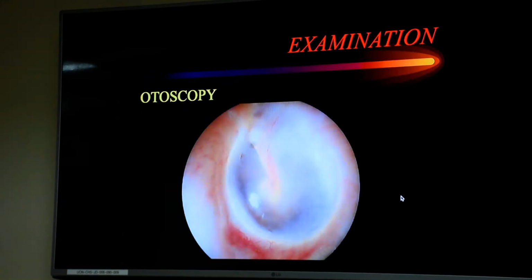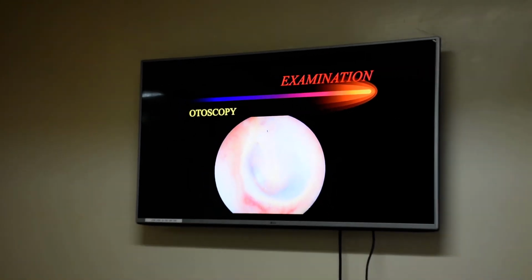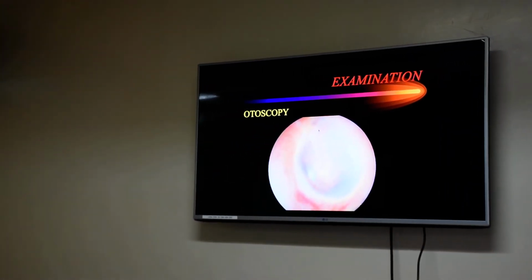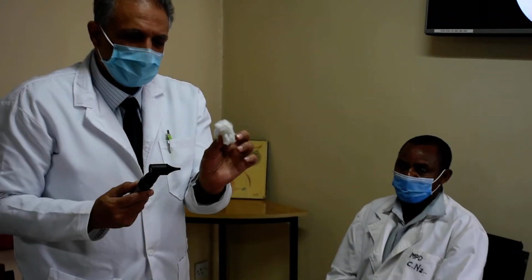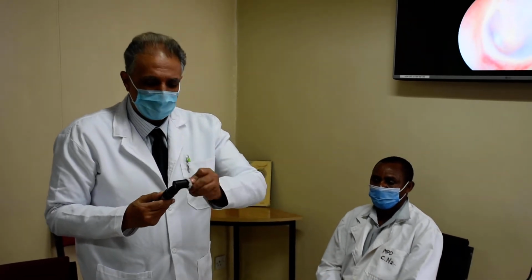So, when we look inside, this is what you're supposed to see: the tympanic membrane and the external auditory canal. I would like now to demonstrate to you. This is our otoscope. The first thing is, of course, you test whether it works. In this case, it's working. You must always use spirit to clean the speculum before and after every examination.